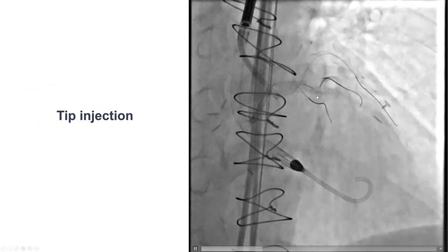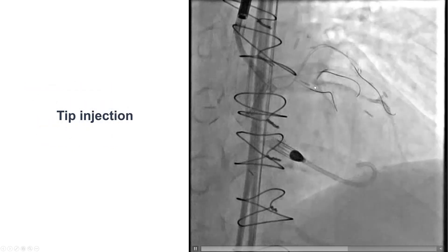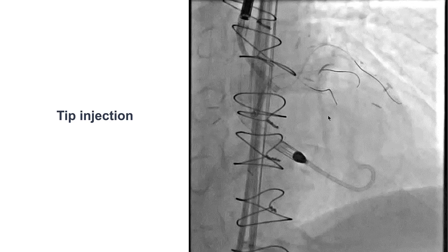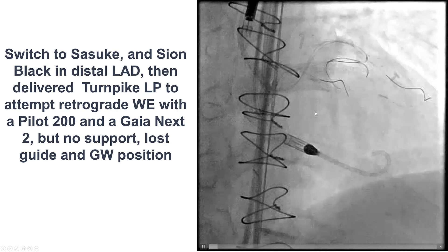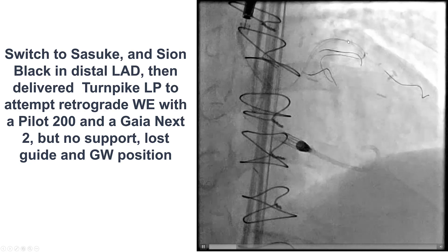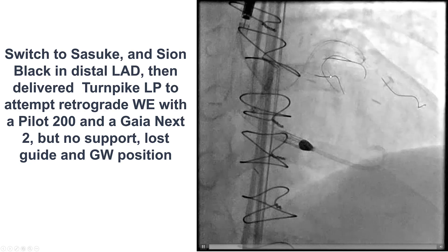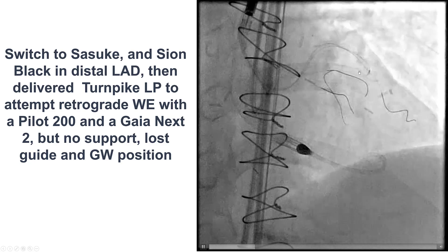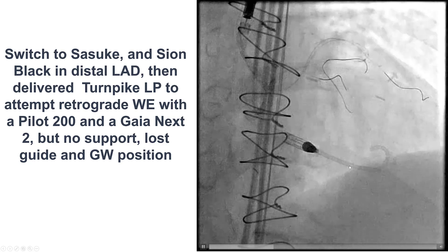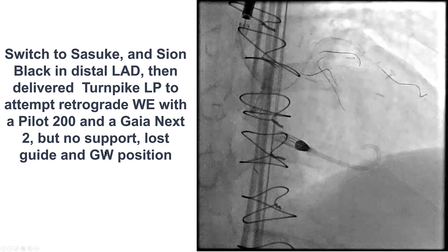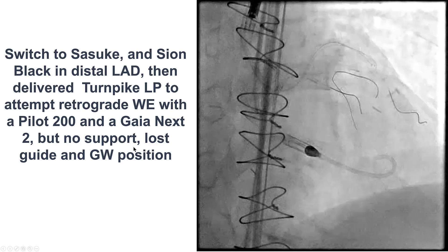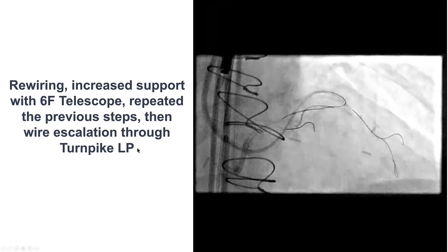We advanced the Turnpike LP. This is a distal tip injection demonstrating the distal cap that was blunt. We had some difficulty with support. We used the Sasuke dual-lumen microcatheter to advance a wire down in the LAD, but the support was not good, and eventually we lost the wire and guide position.